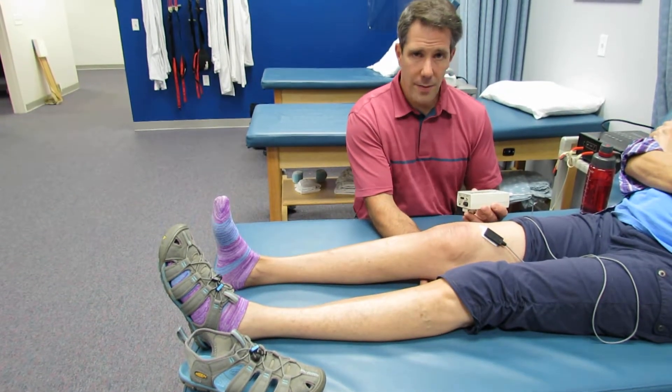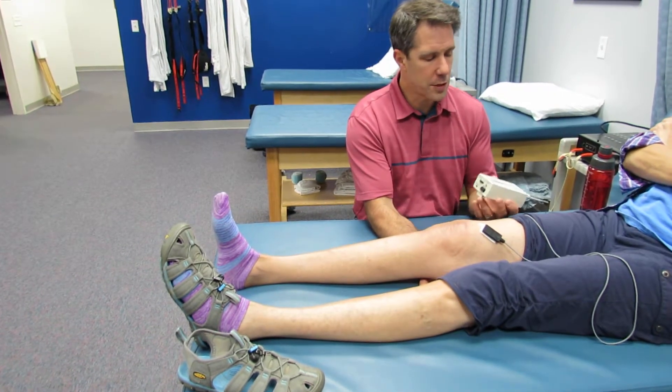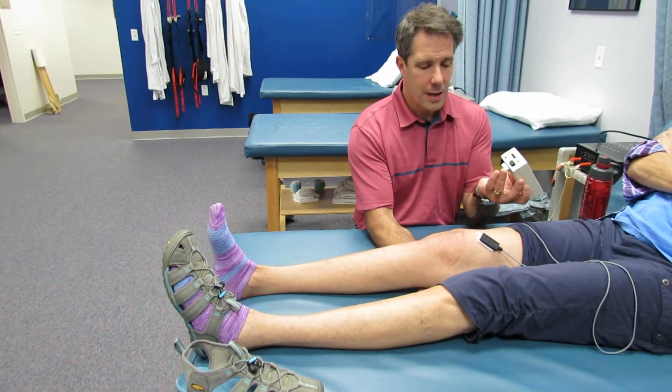I usually have them hold for about three seconds each time. I want you to go ahead and tighten again — push, push, push — take a look at it, that little bar needs to hit the arrow so they get immediate feedback. And rest.